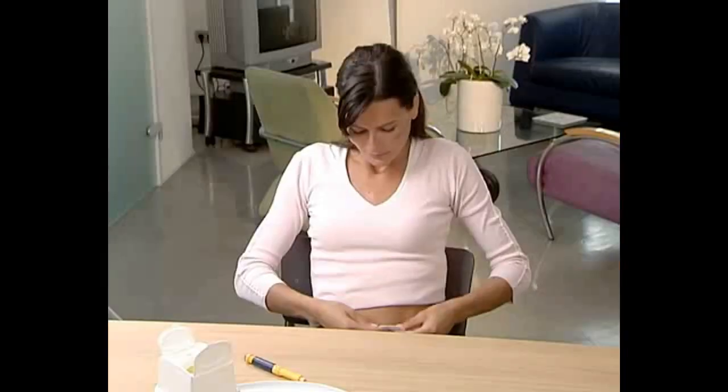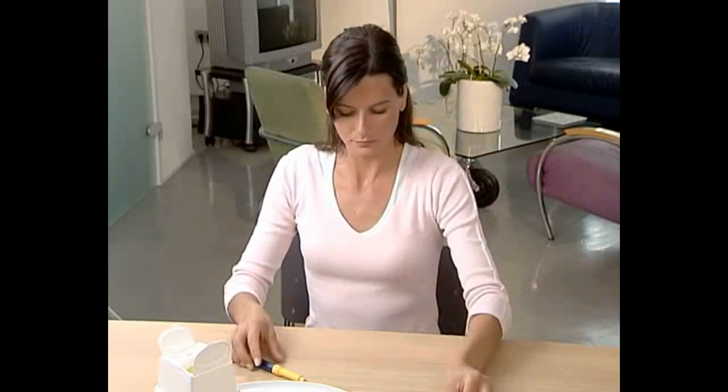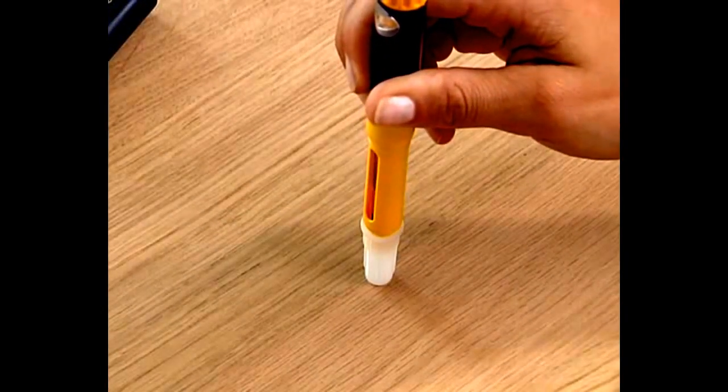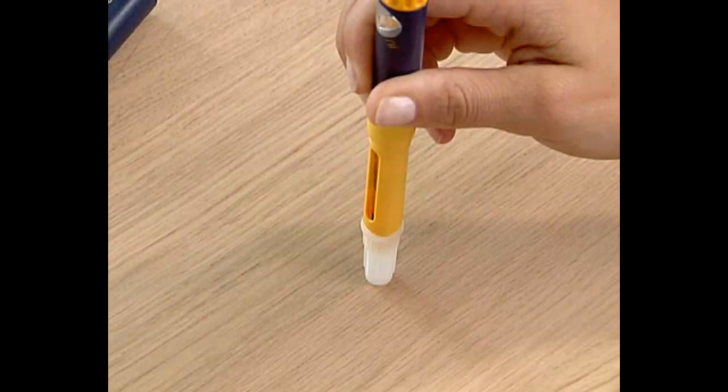In order to avoid injuries, place the outer needle shield on the table with the opening pointing up. Carefully insert the needle, which is still attached to the pen, into the opening of the outer needle shield and push down firmly.